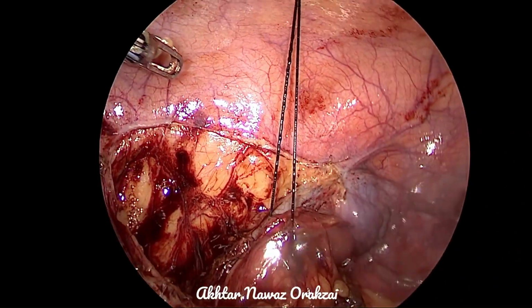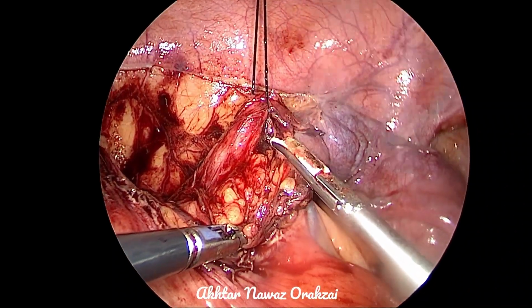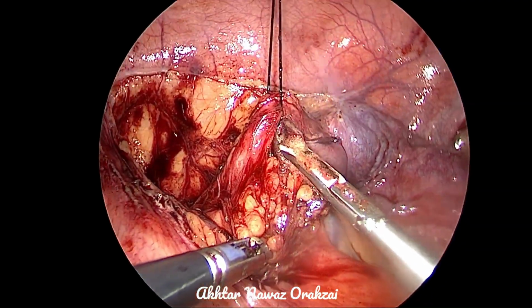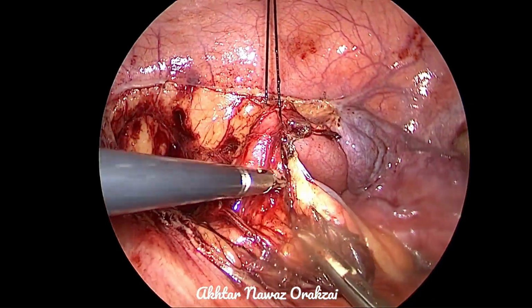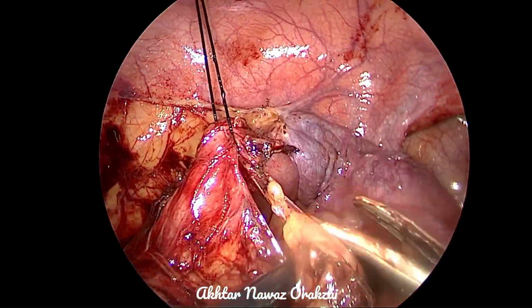So this serves me with a good retraction. So now the formal mobilization of the distal portion of the ureter has begun.